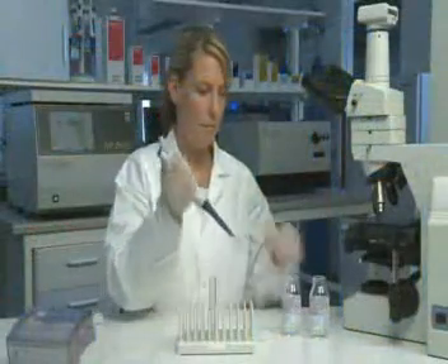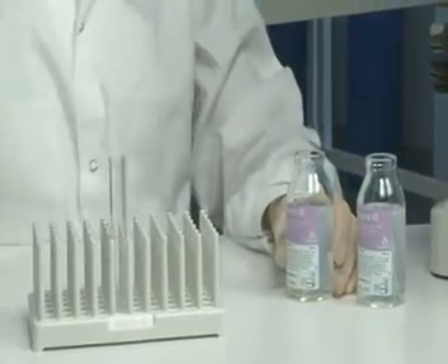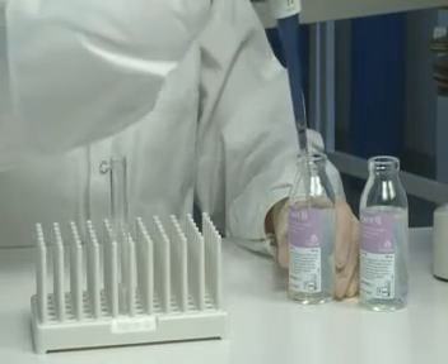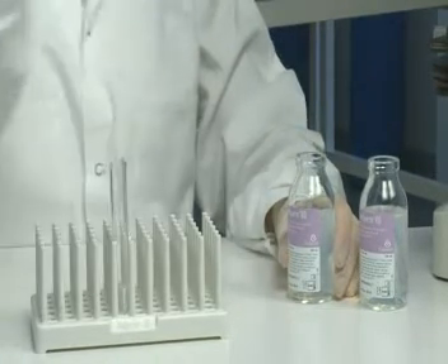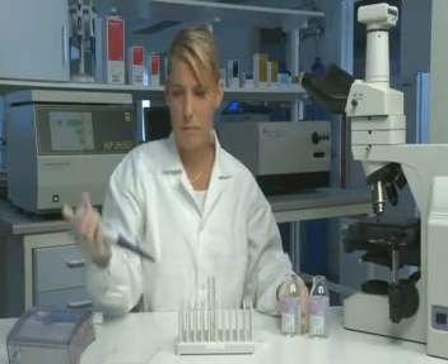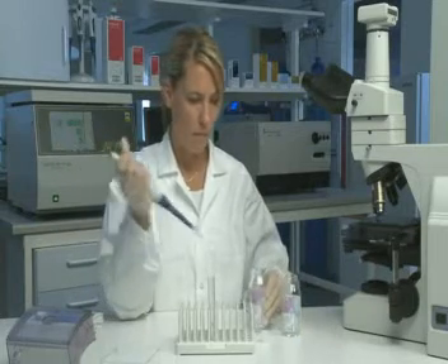Pipette 2ml of PureSperm 80 into a sterile conical centrifuge tube. Carefully layer 2ml of PureSperm 40 on top of PureSperm 80.